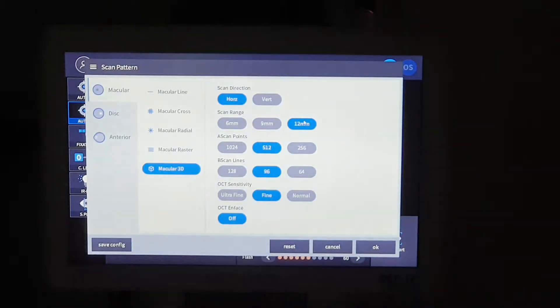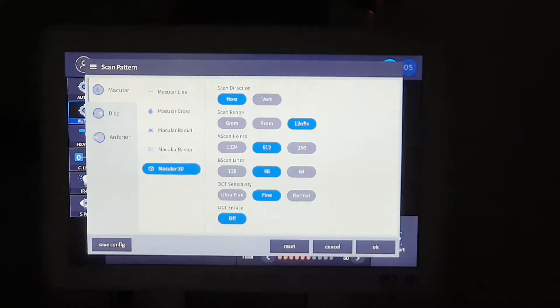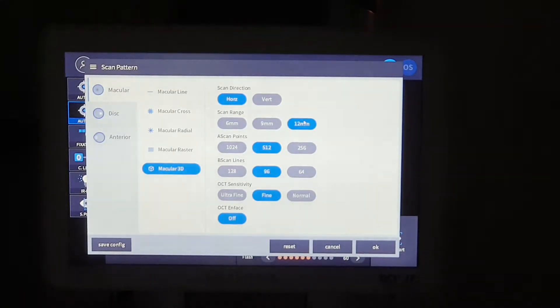We also added new scan range, 12mm. It is wide range, so it can take macular and disk at one time.